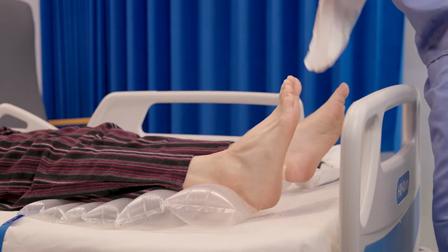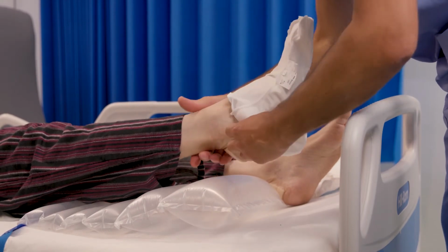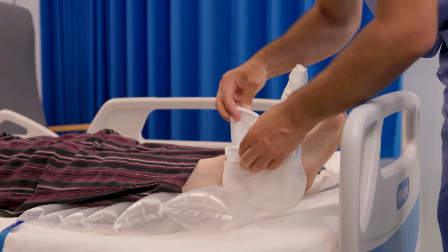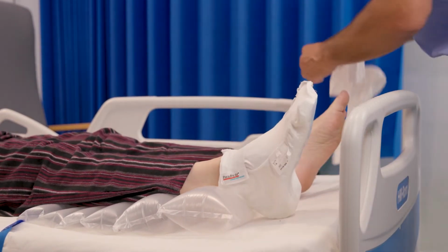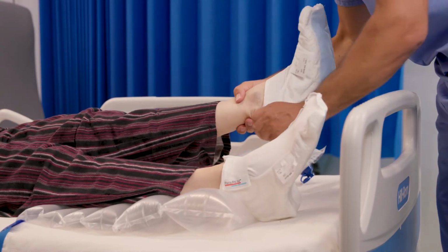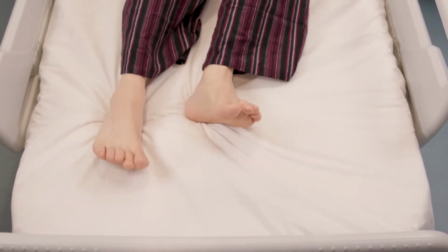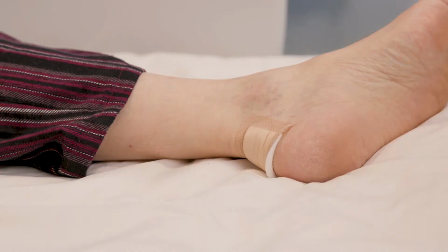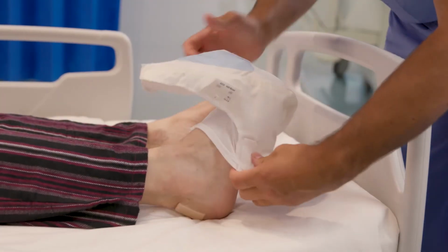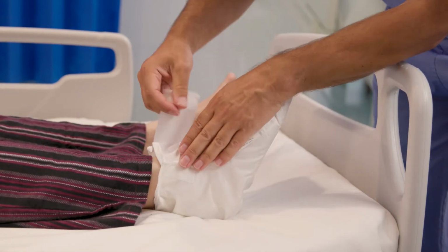Again, if the patient is particularly agitated or unable or unwilling to use an offloading, immobilizing boot, an option is to dress the pressure ulcer, as of course you would do anyway, and then put a pair of Parafricta booties onto their feet. You might also choose to use some elevating mechanisms such as a pillow or a wedge to help reduce the pressure element as well as the friction and shear element. What otherwise often happens is that a dressing will be rucked up or completely sloughed off by the same rubbing action which was the underlying cause of the pressure ulcer in the first place. Therefore, retaining that dressing with a Parafricta bootie is an important added benefit of the combination.